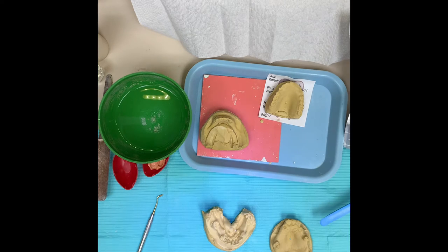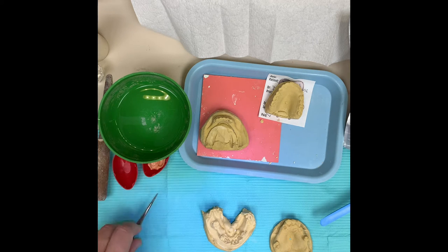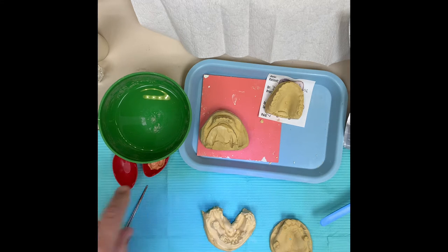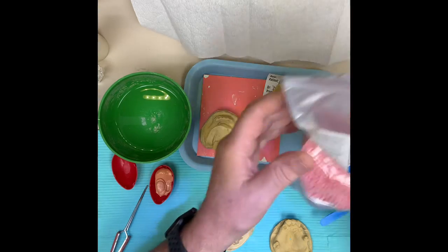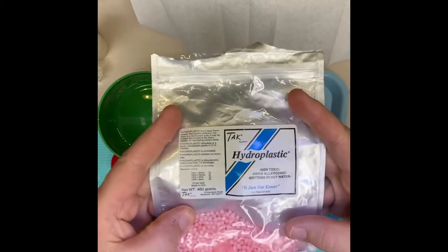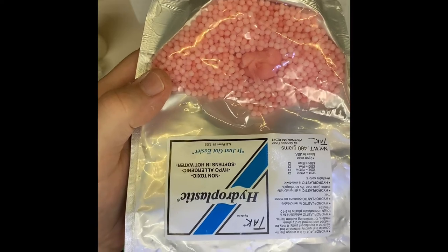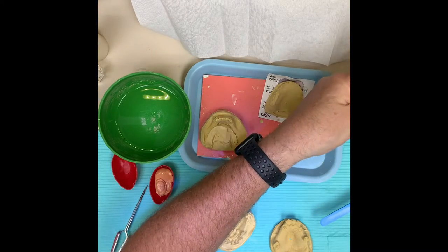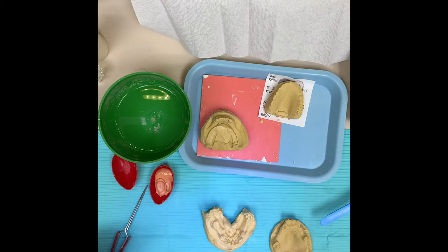The things that you need are some kind of a blunt instrument - it doesn't really matter what you use. You need some silly putty, very important. You need tack material, and this is a really great material to use.